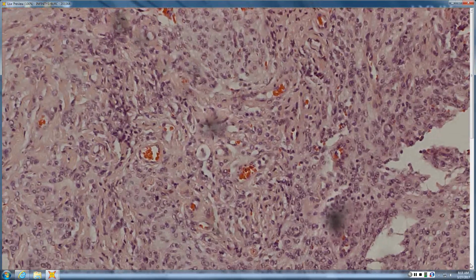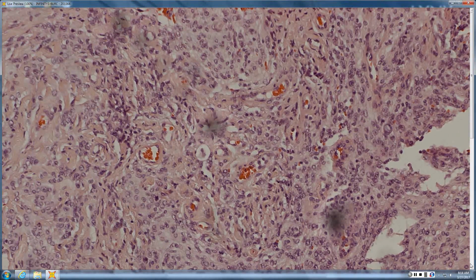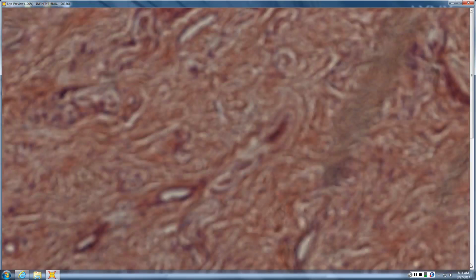Meningothelial whorls, epithelioid cells, you probably don't have to diagnose them, but you need to know they exist, right? You need to know things you can get into trouble with. The world doesn't just consist of the things that are common in skin, and so you have to know when you're potentially out of your realm.